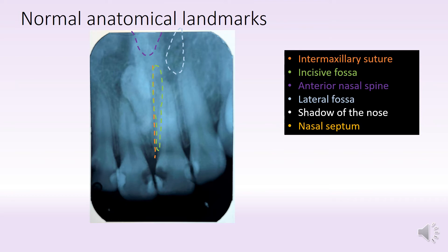You also see the shadow of the nose, which is indicated by this white line here. And of course you see a dense area overlapping the mesiodents, which is the nasal septum. So those are the normal anatomical landmarks seen in this maxillary anterior radiograph.